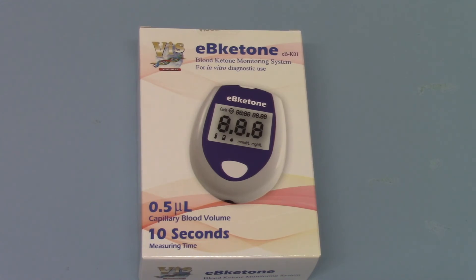So what we're going to do is unbox this now and show you what contents you get, because this is just a starter pack and it doesn't contain everything you need to get tested.